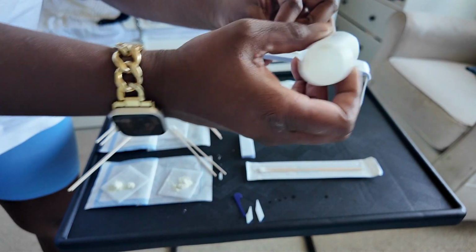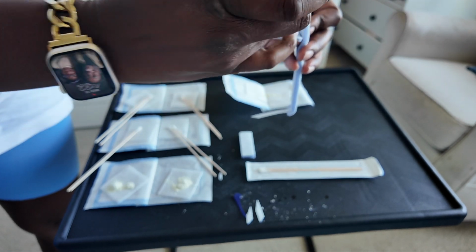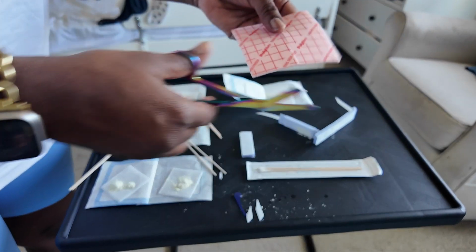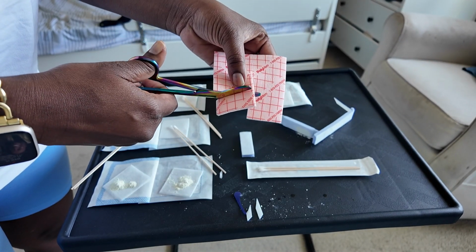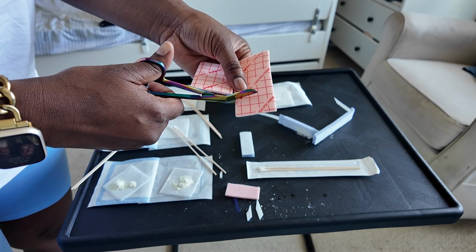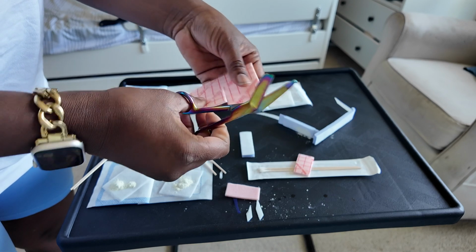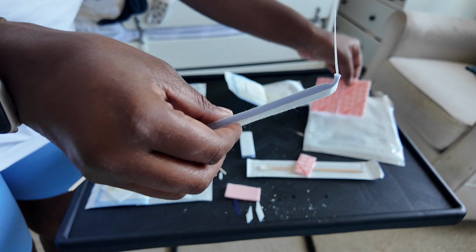I like to put the powder on the ties as well. Again, this is how I do things, how we do it at home. Sometimes in the hospital, you're taught a different way. And I just advise you when you get home to find the way that works for you, because you won't have the hospital bed. You won't have the backup. So there's a lot of things you're just not going to have in this setting at home that you have to adjust and adapt. And we've been doing this for years, and we just found a really good setup for us.